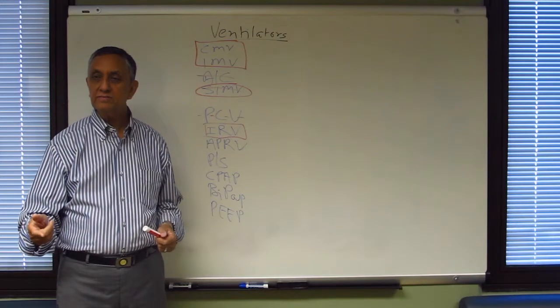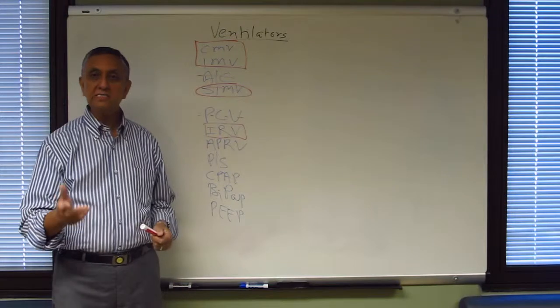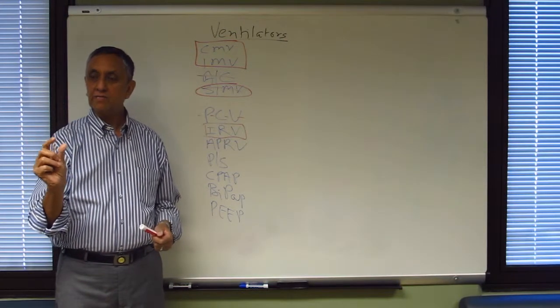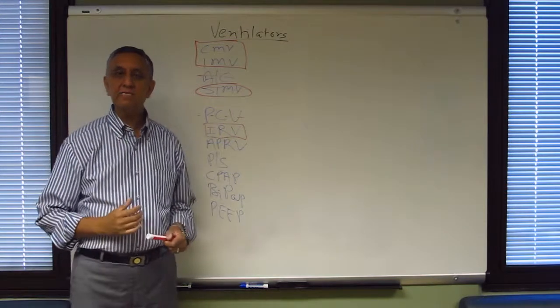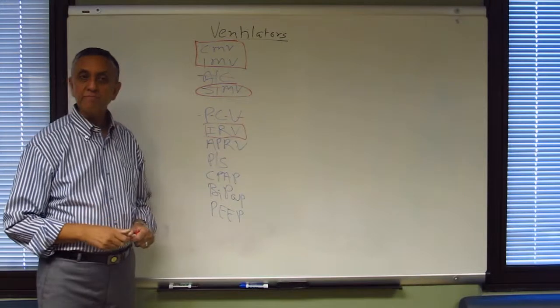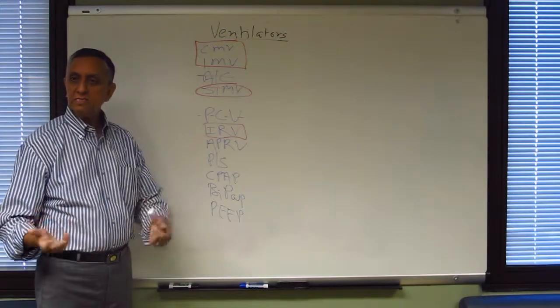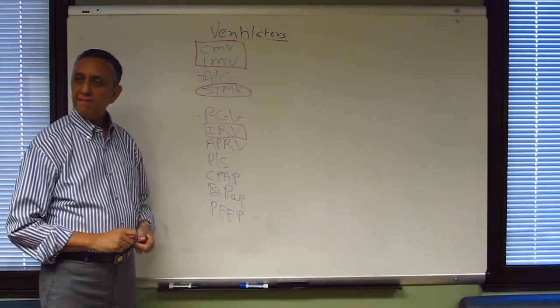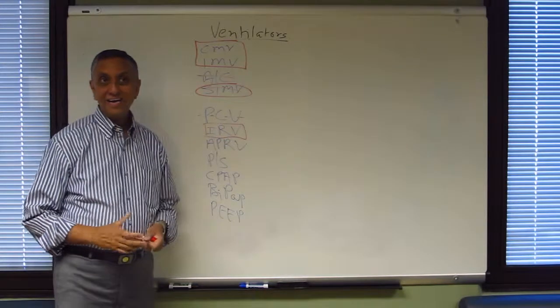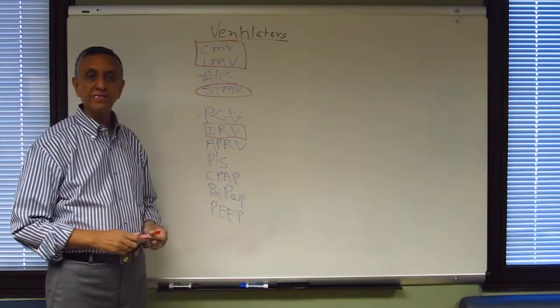So by increasing the inspiratory time and attempting to inverse the IE ratio, you are helping oxygenation at the cost of? CO2 elimination. Right, because your expiratory time is getting shorter. And because of that, there isn't enough elimination of carbon dioxide. So you're going to have hypercapnia in this patient. Just on a side note, how do you treat that hypercapnia? What will you do? Remember, you're maxed out on things. Increased ventilation. You're maxed out on the things that you can do from that machine.